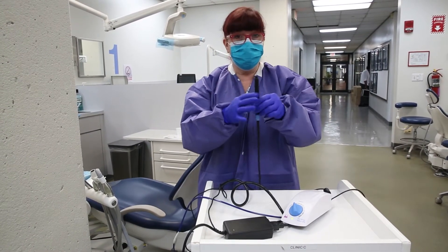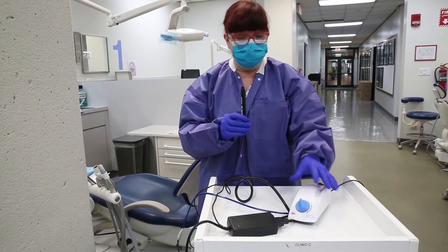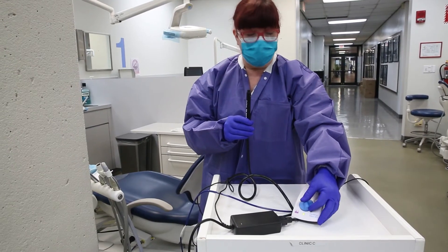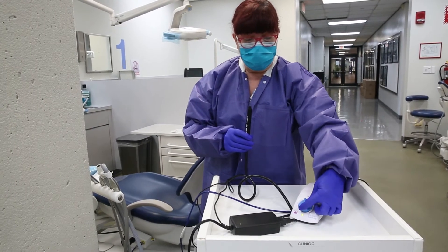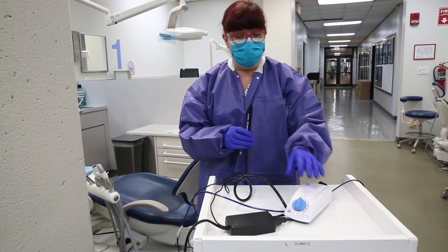Then you would adjust your water just like the bracket table unit in clinics A, B, C, and D — the adjustment is at the bottom. Your power would be adjusted with this blue knob. With this particular unit, the manufacturer recommends that the power should not be turned past the 12 o'clock position. You would have low power here going up to moderate, and then higher power — it should not really go higher than that.